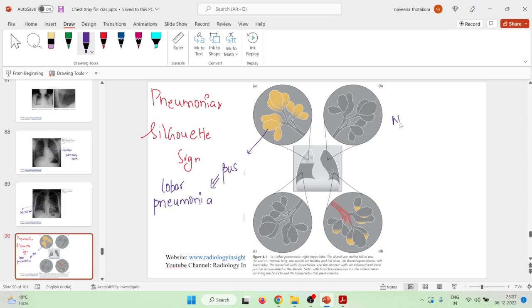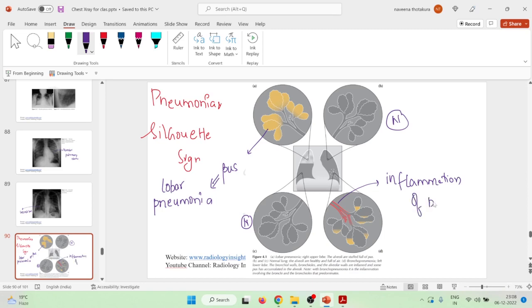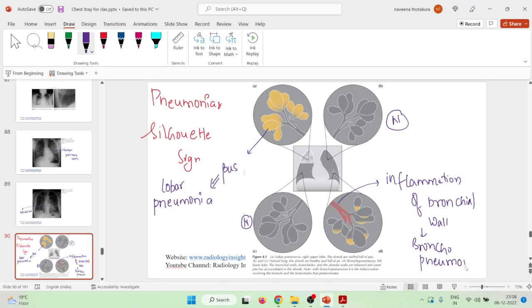Here the alveoli are completely normal. But in another picture, the alveoli are filled with a slight amount of pus and there is inflammation of the bronchial walls. Because of this inflammation of the bronchial walls, this is a type of bronchopneumonia.